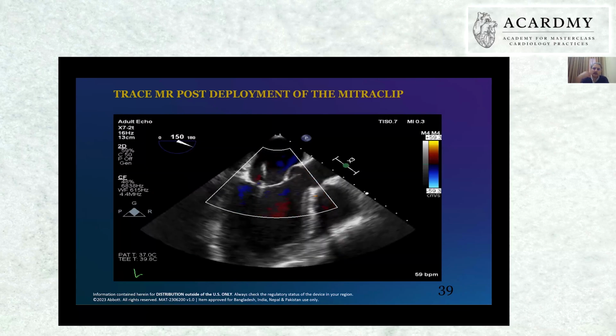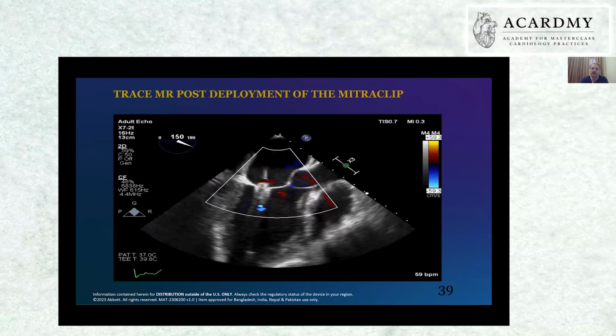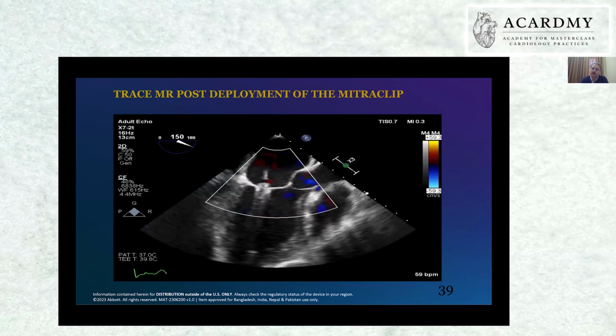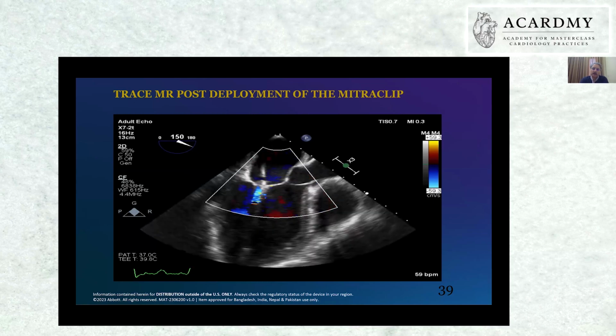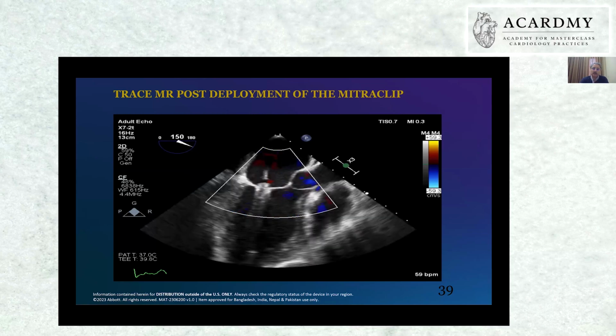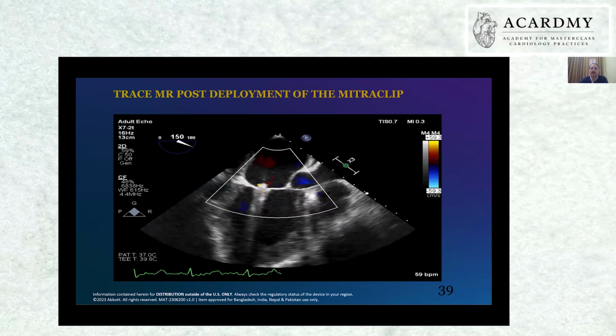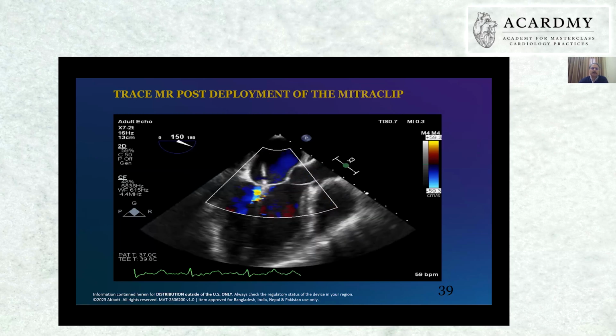And he tells that he can't even walk 5 to 10 steps. He was too disturbed, with torrential MR. And we got a very good result. So now he's saying that the feeling of breathlessness is totally gone. So I think it's slightly incomplete, but I'll have better slides to show you how it is done.